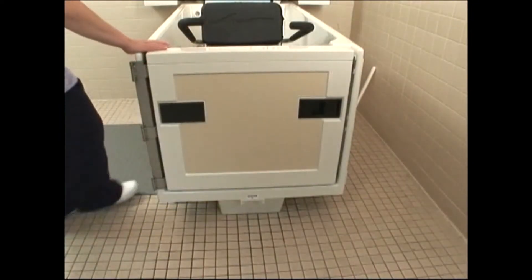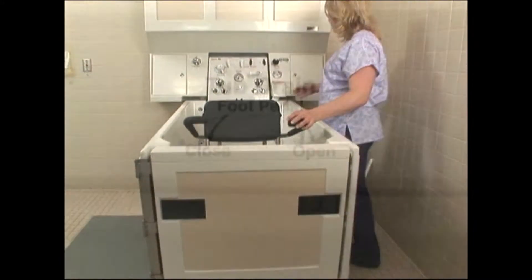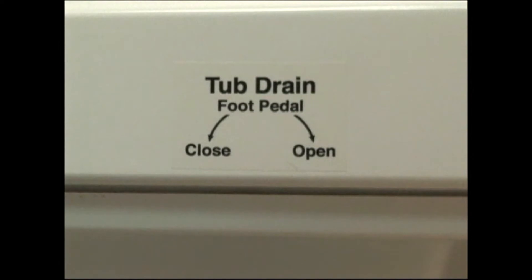Close the door, making sure that it is flush against the gaskets, and lock the door handle. Close the tub drain by depressing the foot pedal located on either side of the tub along the base. Arrows depicting the proper drain closing and opening directions are located next to the pedal.